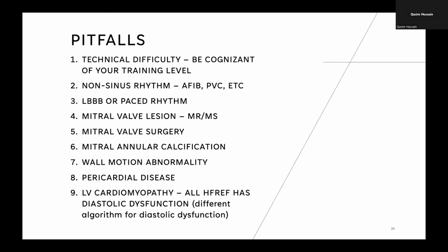But there are some pitfalls to take into consideration when using these assessments. So first and foremost, I just want to talk about the technical difficulty of these assessments. They are tough. You need a degree of ambidextrous ability, just because you have to have one hand on the probe, holding it still, manipulating the machine, trying to get all these measurements, and then just be cognizant of your level of training with any kind of intervention that you're doing. So point of care ultrasound included, you never want to use this as an exclusive magic bullet to solve everything for you. It's just another data point in the entire clinical picture, right? Especially there can be false negatives, false positives in these measurements as well.